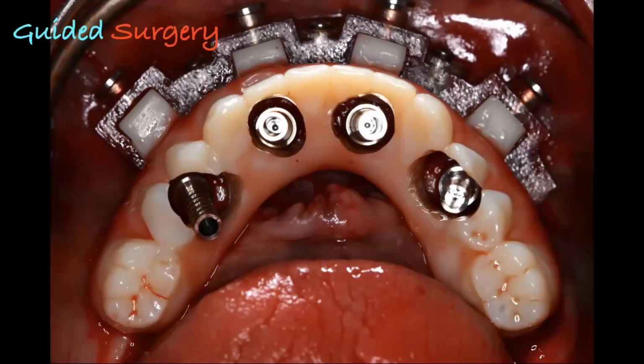So when it comes to using CBCT in guided surgery, there are lots of different ways to do this. This is a stackable surgical guide, where you see a lot of these now with the N sequences, the FTXs, the 360 imaging, the chromes out there.